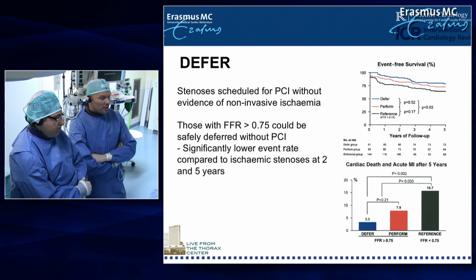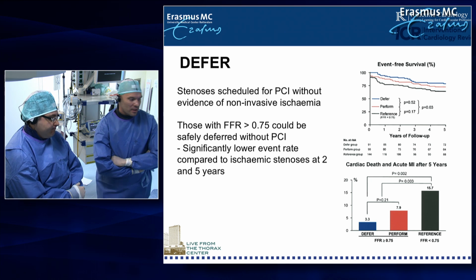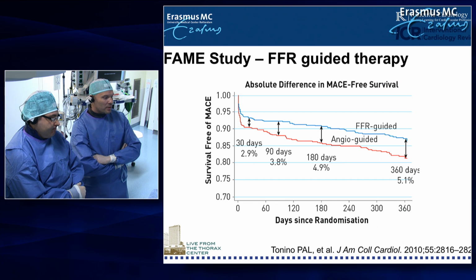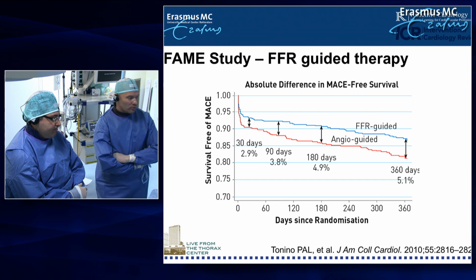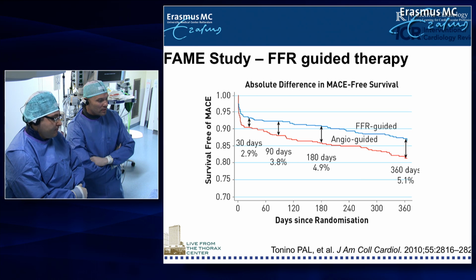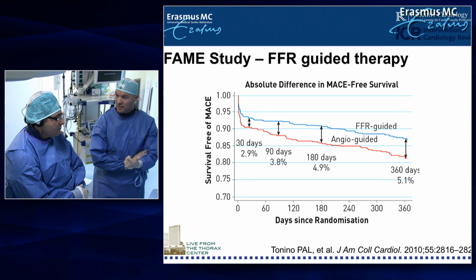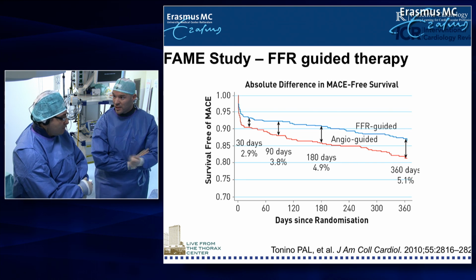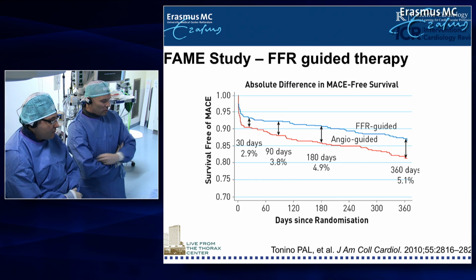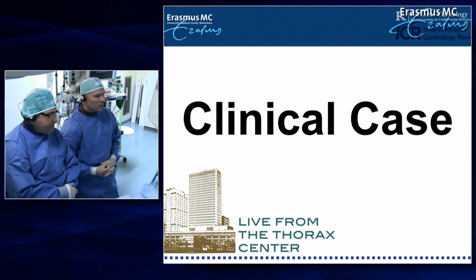So maybe the key study on the value of FFR was the FAME trial. And the FAME trial was published in the New England Journal a couple of years ago by our colleagues from Eindhoven and Aalst. And this was very impressive, I think. We had a reduction in major adverse events in the FFR-guided group, but also you used fewer stents and you ended up treating fewer vessels. So it was also economically very attractive. So maybe without further ado, we could go to our clinical case for today.